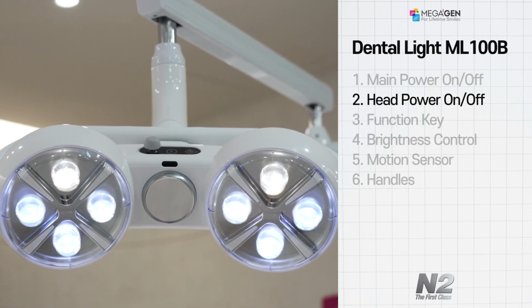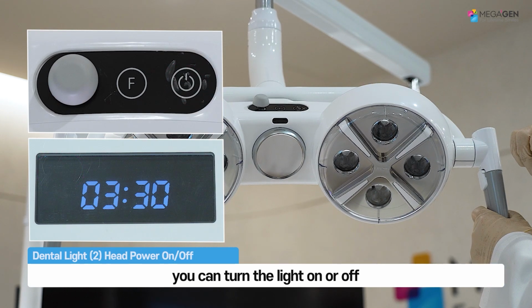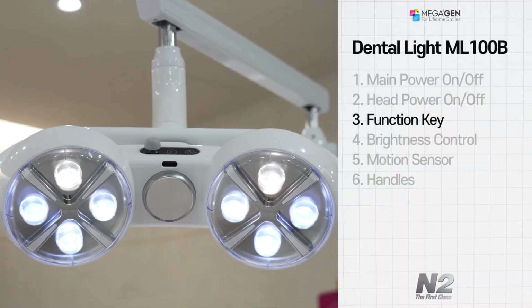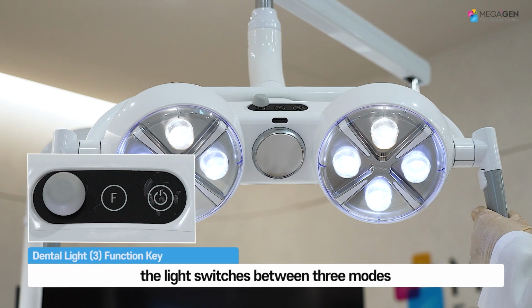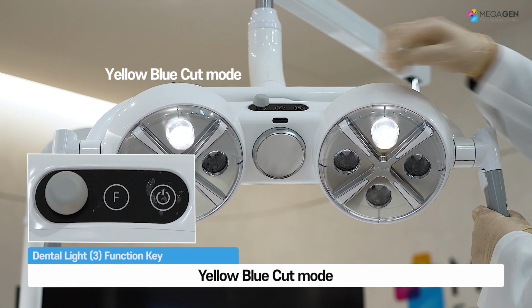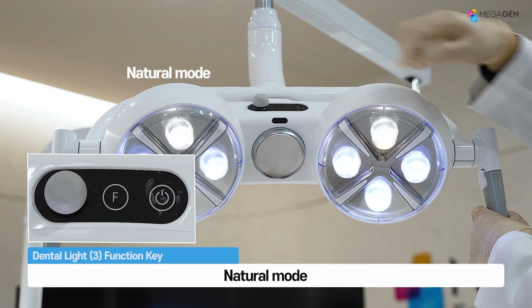Manual control of power on the light head. Separate from the chair's light power control, you can turn the light on or off by touching the power button on the light head. Function button, features of the ML100B light. Each time you press the function button on the light head, the light switches between 3 modes. Yellow-blue cut mode. White prosthetic shade matching mode. Natural mode.